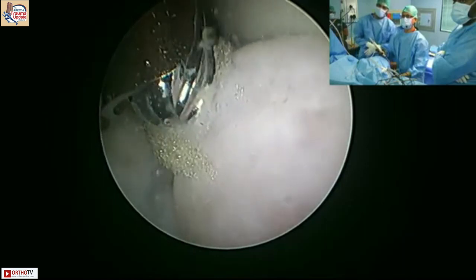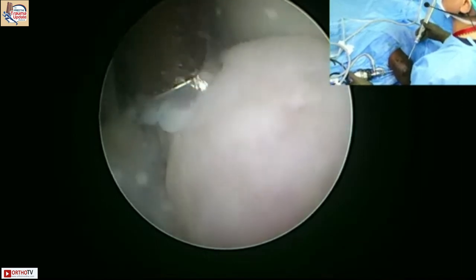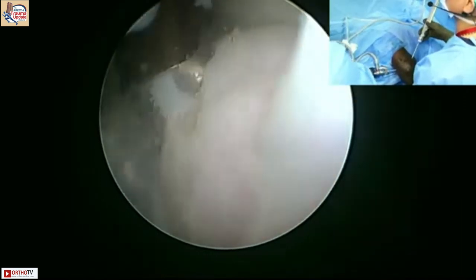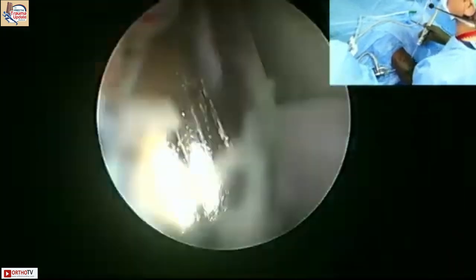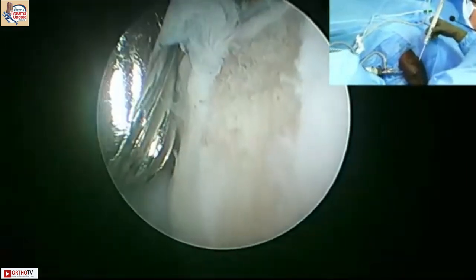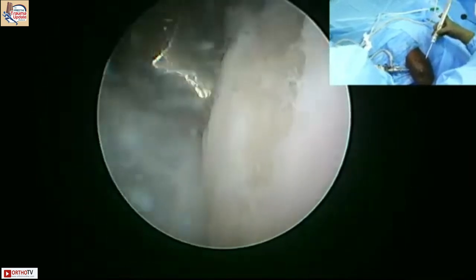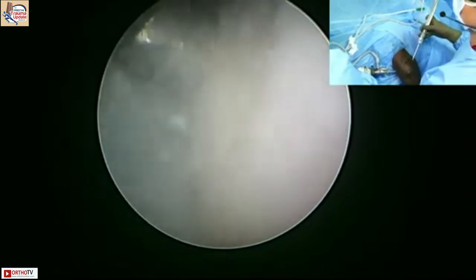So what is the burr set at? Can you put a little bit of suction on this? No, it goes off fully. My suction is too strong. Silam, just keep it midway rather than complete. No, yeah, but the inherent pressure of the suction is too strong. Okay, doesn't matter. Don't worry, I'll sort this.